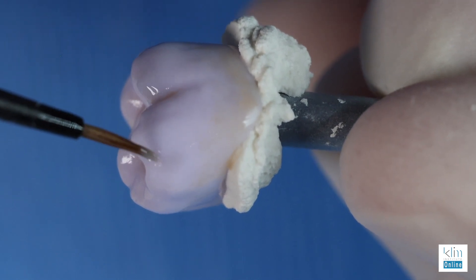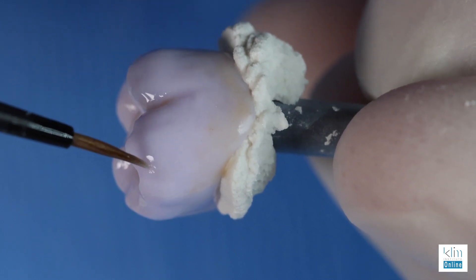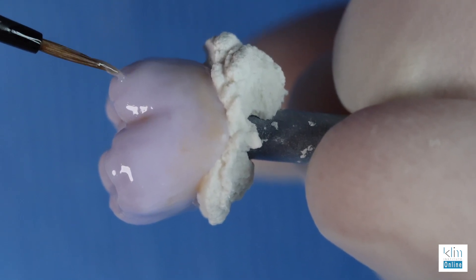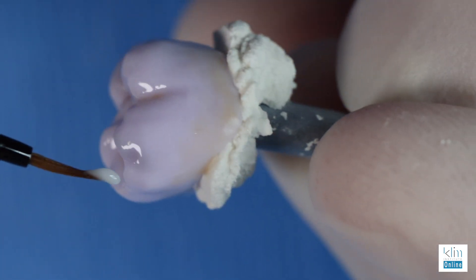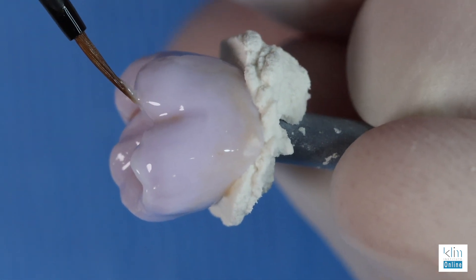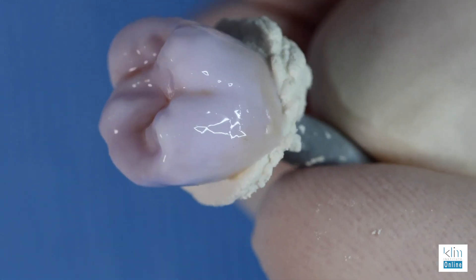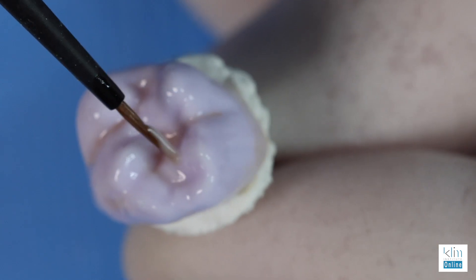Depending on the case, if we need to make the cusp tips a little more translucent, this is where smoke is excellent. A light application of smoke will bring down that value and provide that nice translucency. You can see it's really subtle, but it's going to look great. And then we can pop and punch those cusp tips with lumen — that creates a little more of an enamel look and will emphasize the lower value in contrast. It's a nice technique to know, it's going to be very subtle. I also like to place lumen on the non-functional occlusal zones — it will brighten up those triangular ridges where we don't have the function.